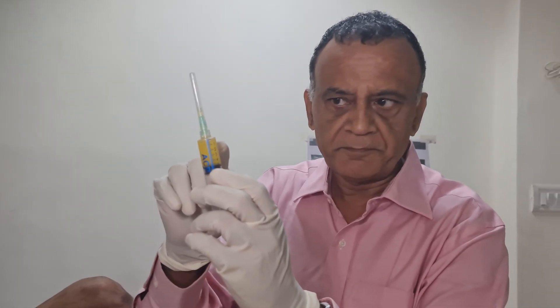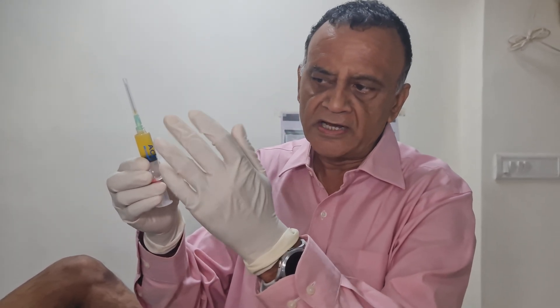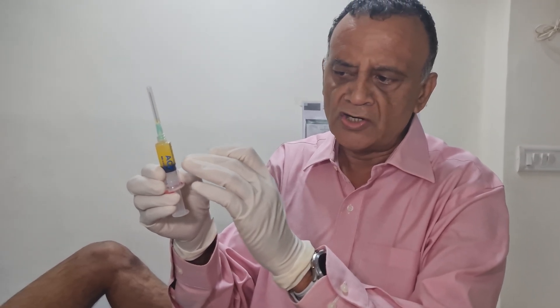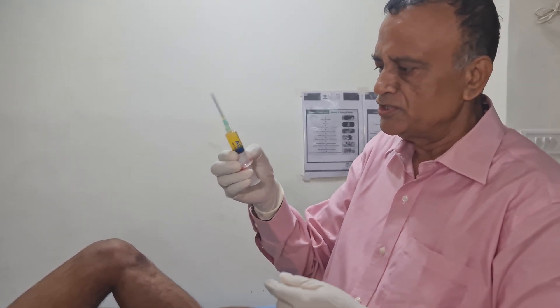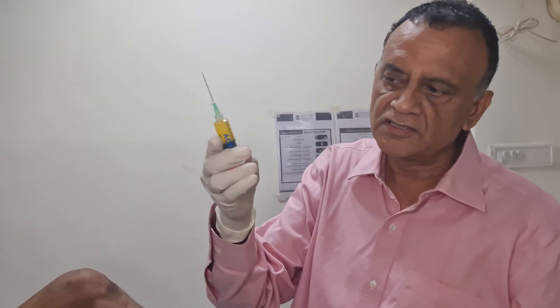Now I am ready to give PRP. This is PRP — it is about 5 ml. Look at this color. This is a pearl color, it is called amber color. The blood was processed and the color is yellow. The red blood cells and white blood cells were removed by the centrifuge.